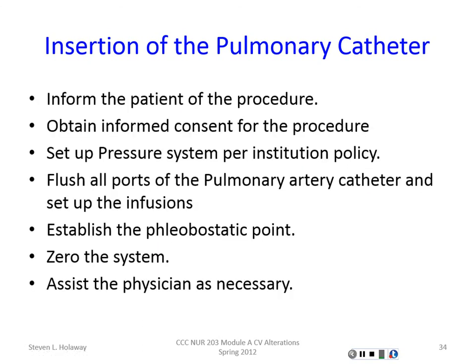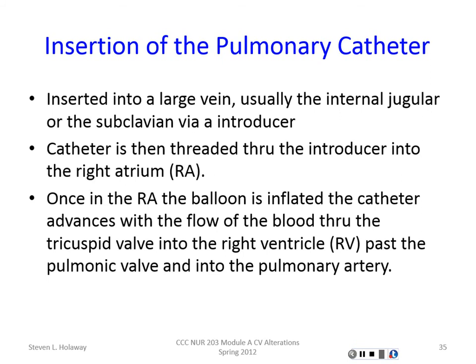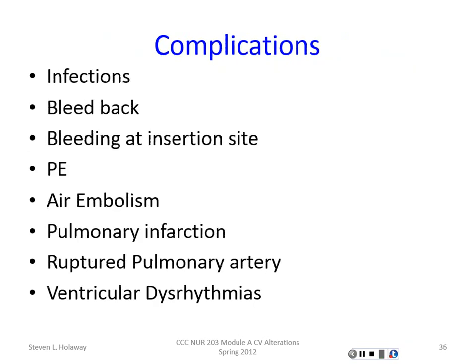Your roles, we've talked about this. Basically, you do have to get informed consent of the patient to do this, so that may be part of your policy. You're going to set up the pressure, you're going to flush all the ports, you're going to establish the phlebostatic axis, and we'll talk about zeroing when we do the lab section, and then you'll assist that physician as necessary. We've kind of talked about this, large vein, all the way through.